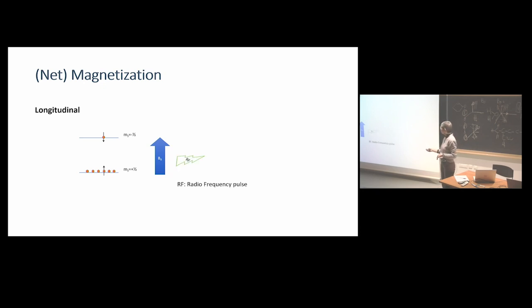So therefore, we have to tickle it a little bit, and we tickle it by using a radio frequency pulse, which oscillates at the Larmor frequency so that it matches this energy gap, and that energy will be absorbed by the hydrogens of the water. And then, in that process, we create something called transverse magnetization. This is my little personal view of this, not very quantum mechanically correct.